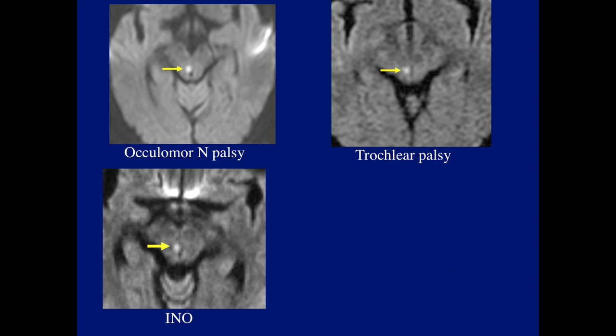Okay, now, why did I want to talk about INO and the MLF? Because here's the issue. Here's an oculomotor nerve lesion, a trochlear nerve lesion, and an MLF lesion. I think it's impossible to really differentiate each one clinically. So already it's a huge success if when we read the cases we at least point out what the lesion may be. And you need the clinician's help or look in EPIC to try to see which of these three possibilities is the most likely, because they all look the same.